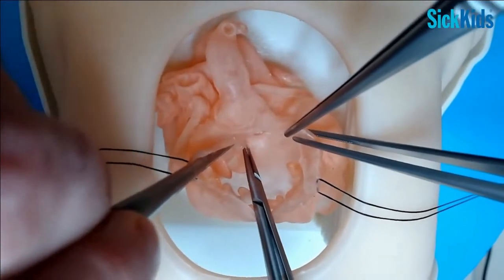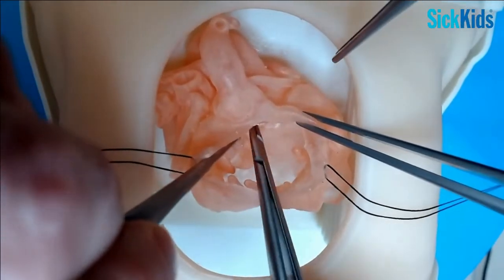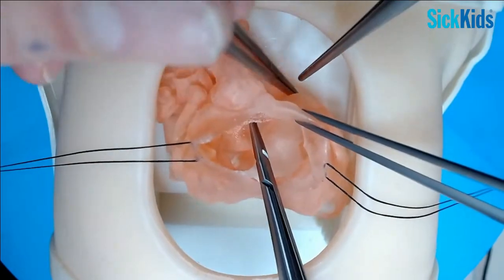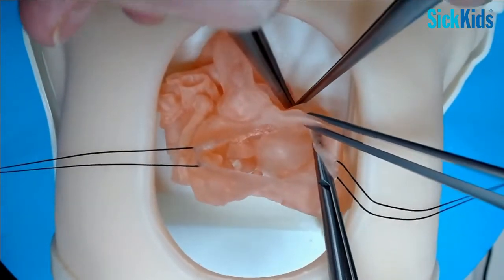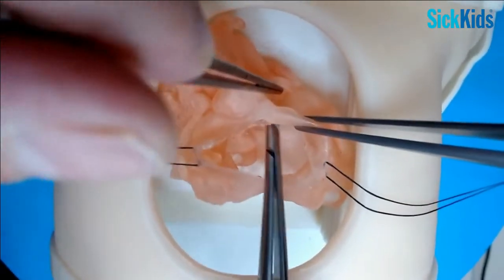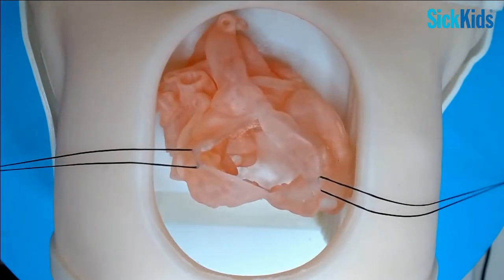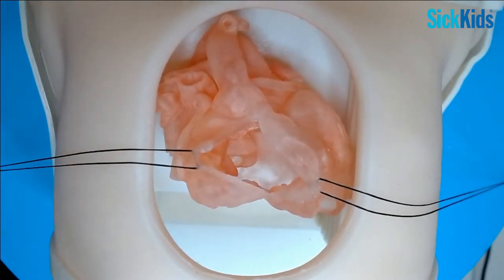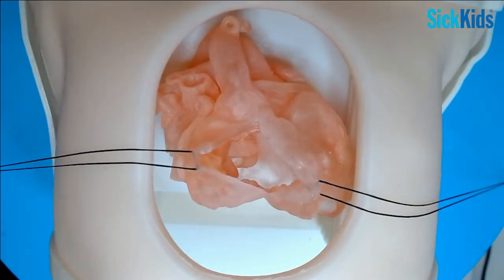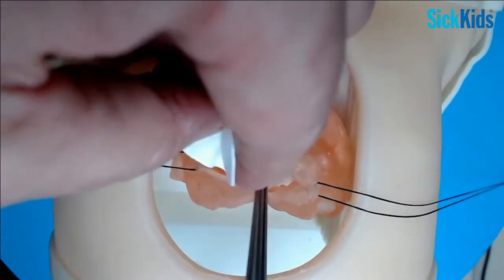So here's the tricuspid valve leaflets - you can see them there. Here's your VSD, here's your pulmonary valve. It's going to actually help me to push in from the outside to see that lateral wall of the VSD, to come up through to the pulmonary valve. The patch is quite big - you have to make an easy straight run from that VSD up around the pulmonary valve.